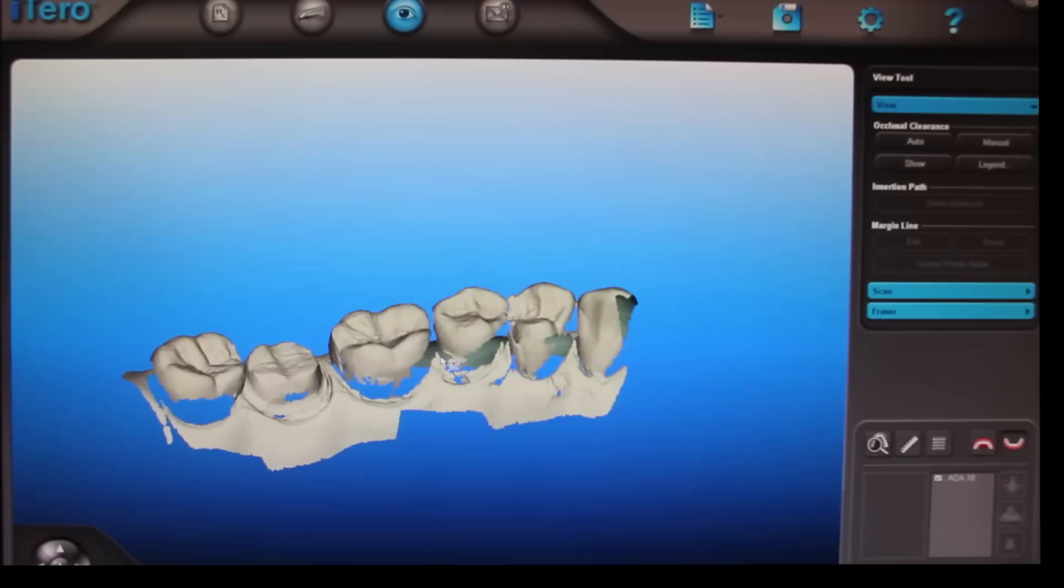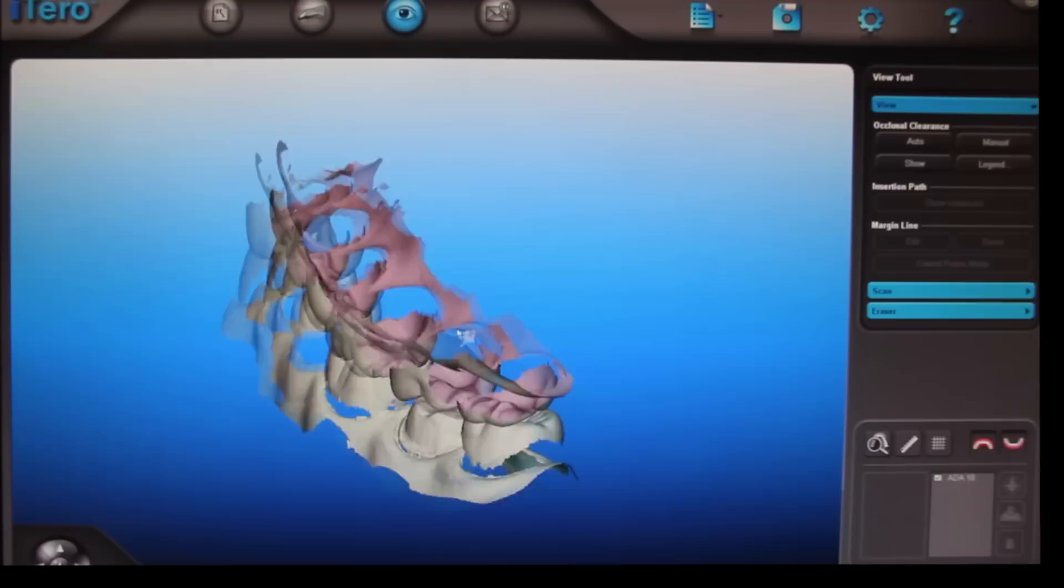If we put the other jaw on it, then you can spin it around and see how the bite is, to see how the teeth fit together. And then from this point, if you like how it looks, we hit send. And it's sent off to the lab in New Jersey where a model is made out of polyurethane, which is like bowling ball material. And then it's sent to our laboratory in Virginia where they fabricate the crown.